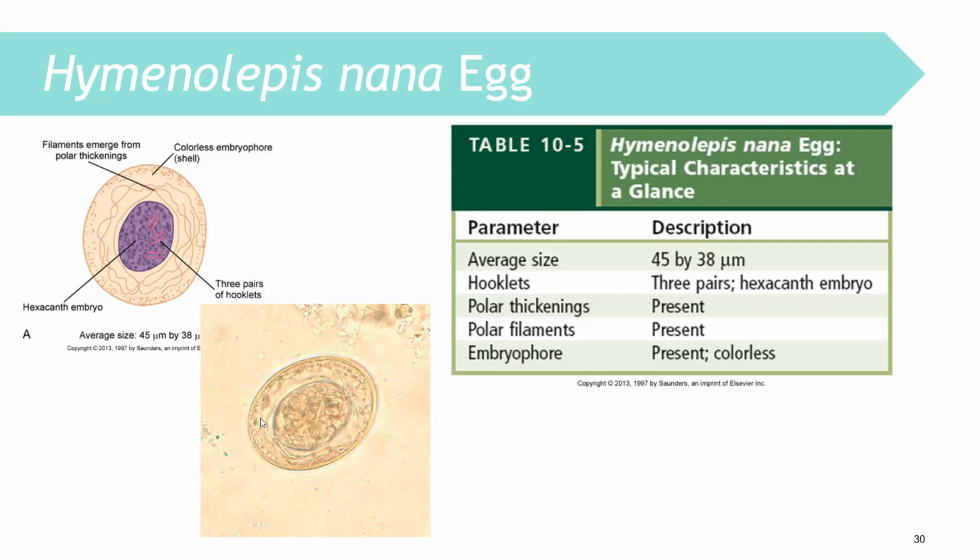But again, if your microscope is not capable of measuring the size, then we have to remember that if there are polar filaments like this, that is your nana.